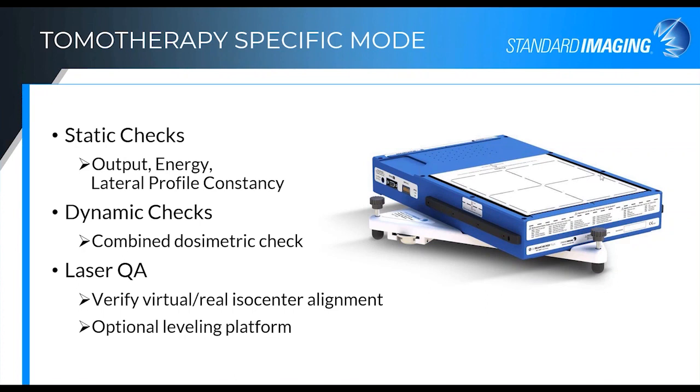you'd take your daily image with the tomotherapy device and then compare that to the treatment plan version, the CT that you have of it. And those balls in there, the fiducials, would then allow you to do that daily image guidance and adjust this to the exact position for treatment.